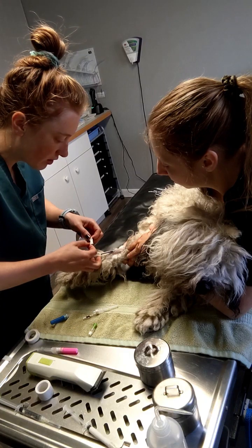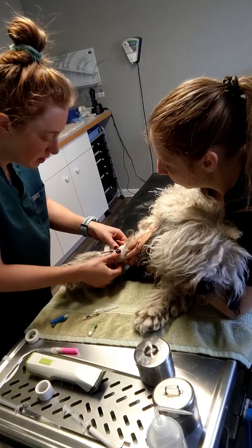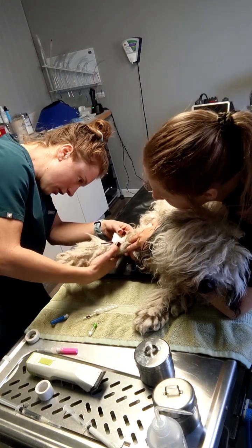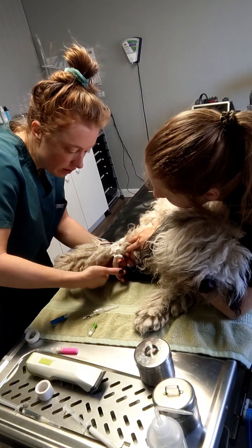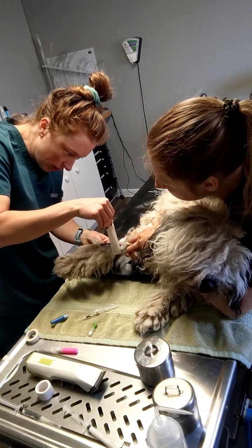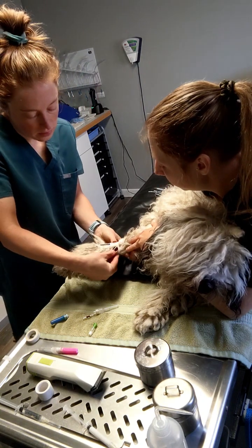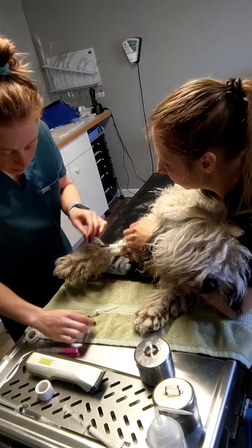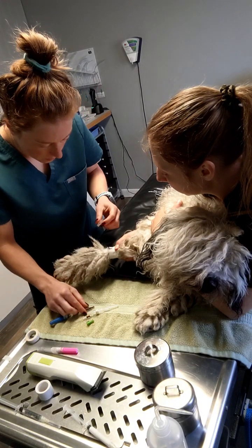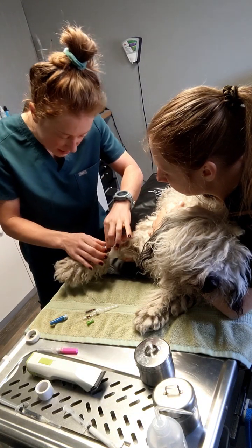And then I want to secure the catheter using a couple different pieces of tape. We've got some slits cut in them so they can be seated around the catheter. And make sure to wrap snugly around the leg. After the first piece of tape, I'm going to add my port in, which should twist into place, so I want to make sure that's snug.